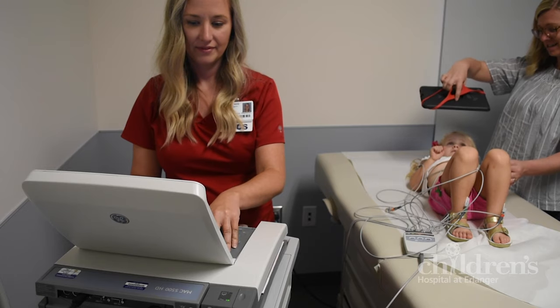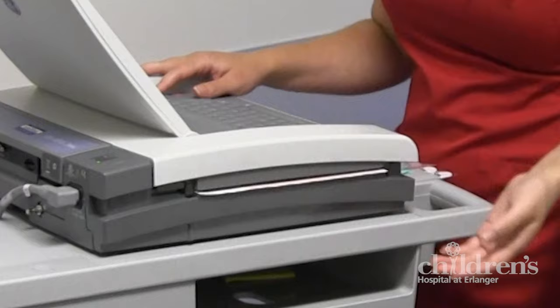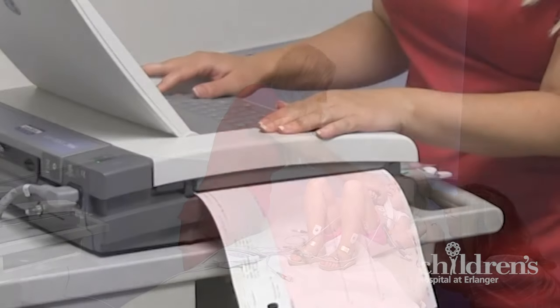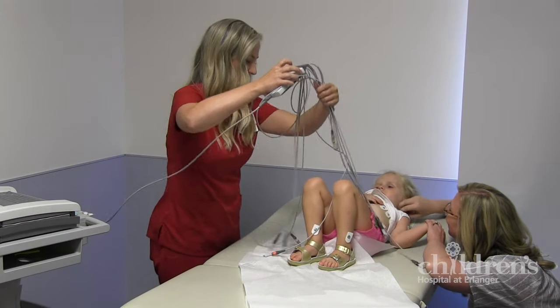It only takes a few minutes. In fact, here comes the report now. Your EKG is already over. Next, we will take off the leads and the stickers and you are done.